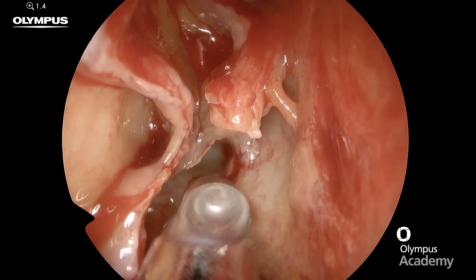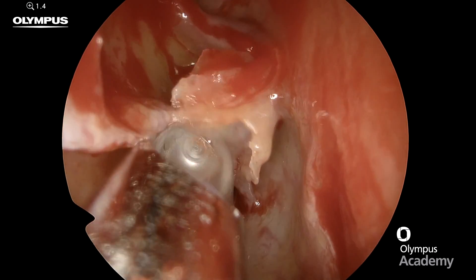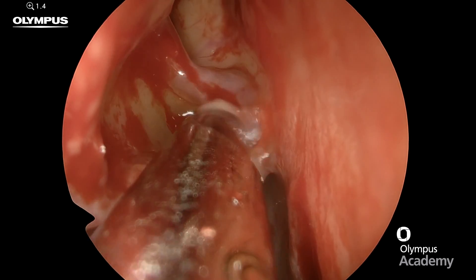It's important to make sure we remove all these fragments at the top part of the bulla and in these supra bulla cells.